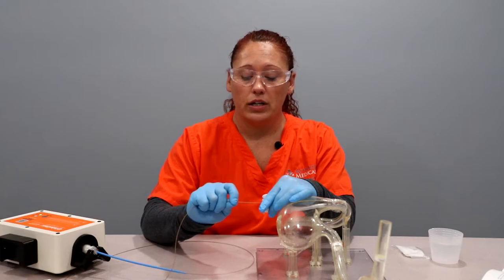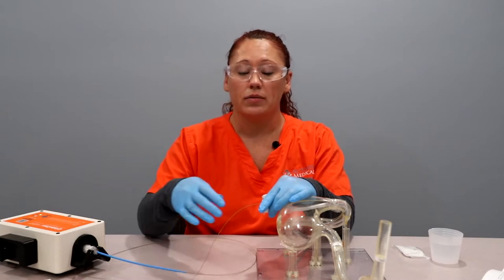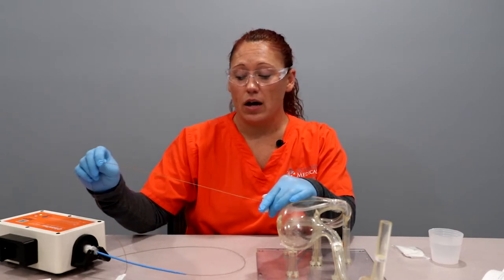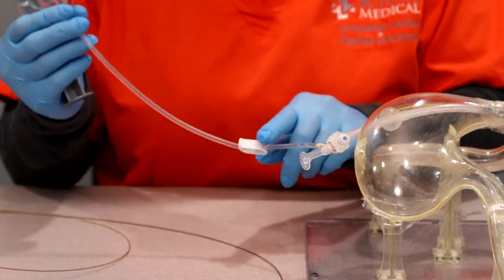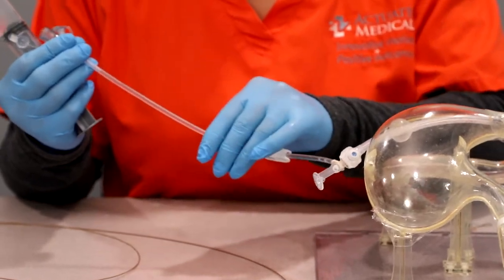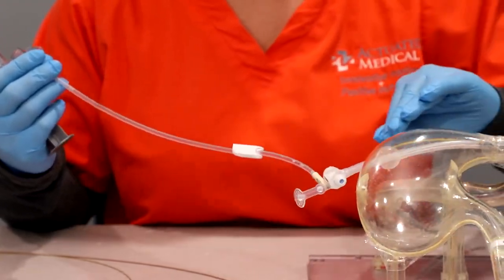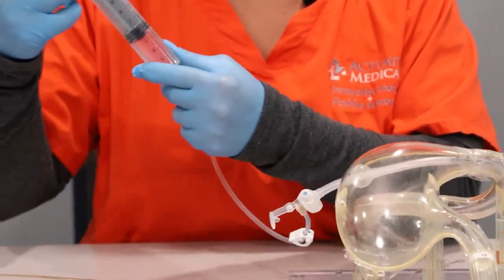Slowly pull the Clearing Stem out. This will spread whatever clog that you were working on — it will help spread it so it will be easier. When we take that out, we're going to do some flushing and aspirating. It's a good idea to have your extension kit primed so that you're not just pushing air into the tube, you're pushing water. So we're going to flush and aspirate with a little pumping action.